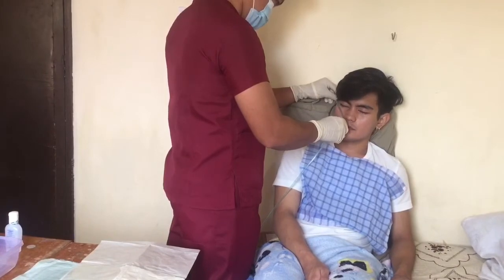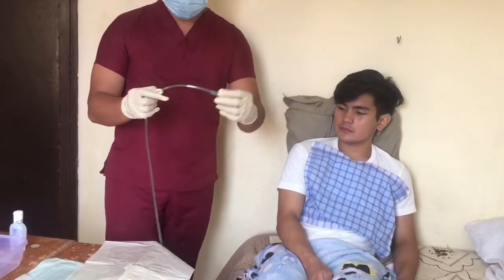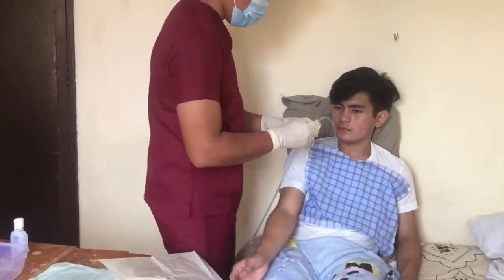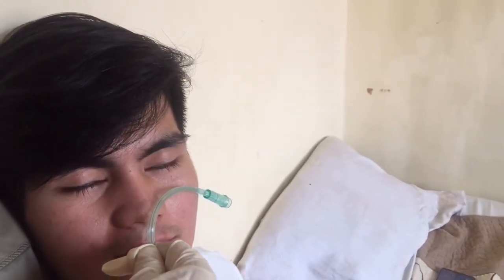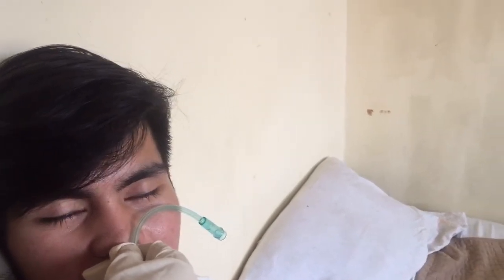Mark the position on the tube with the fingers of the sterile glove hand. Insert the catheter to the pre-measured or recommended distance into either nares and advance it along the floor of the nasal cavity. Never force the catheter against an obstruction. If one nostril is obstructed, try the other.